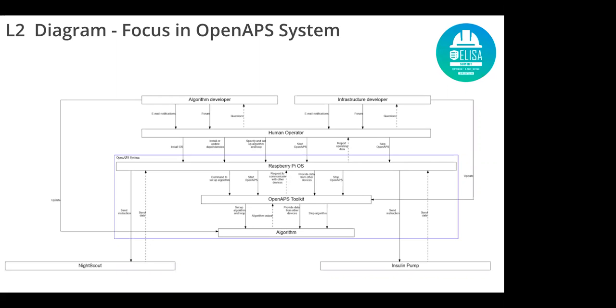So breaking down the OpenAPS rig into different components of the application. You can see the different actions there.